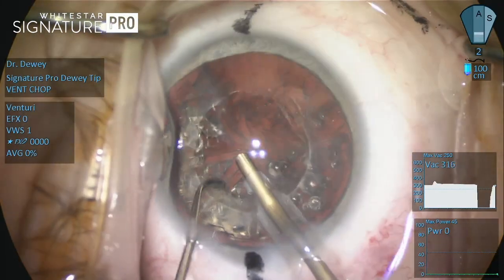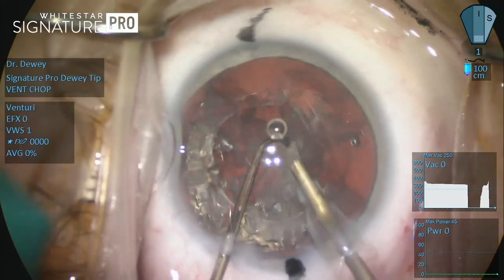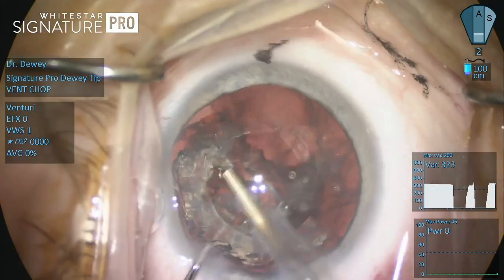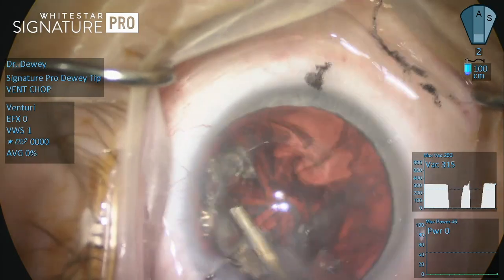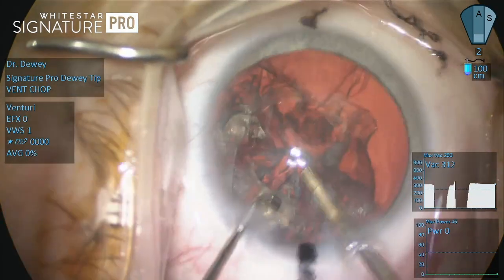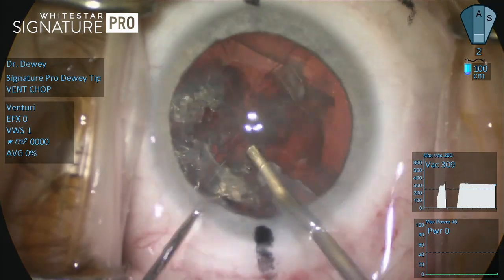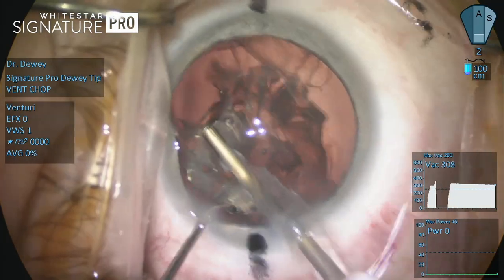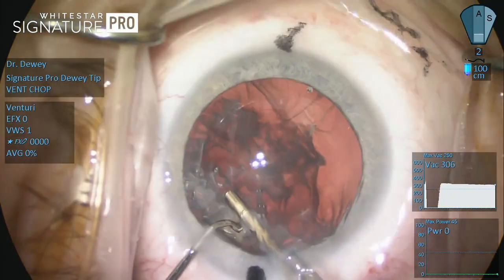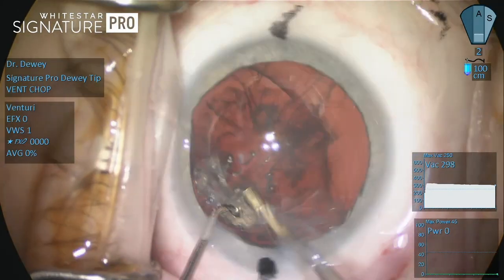This case clearly identifies the advantages of venturi vacuum. First, the speed at which vacuum is created can be much faster compared to a peristaltic system. Second, at lower levels of vacuum, the effect is more constant, as compared to a peristaltic system which can fluctuate based on the relative occlusion status of the tip.